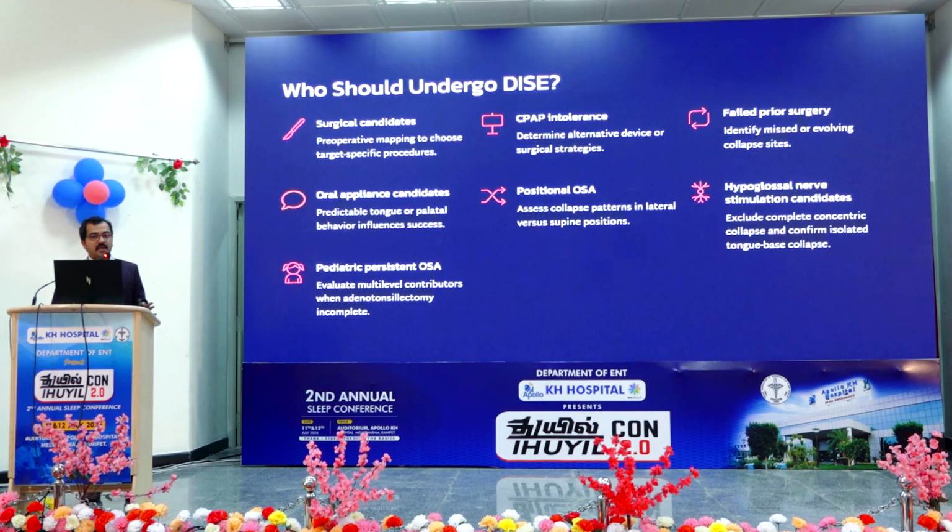DISE should be done in all patients who are... Morning Sir has had a wonderful discussion in the oration. He discussed pediatric OSA, pediatric DISE. So all persistent OSA patients should have DISE. And suppose before taking for adenotonsillectomy, if the adenoids and tonsils are not matching with the size, clinical history or the patient symptoms, then do a DISE.